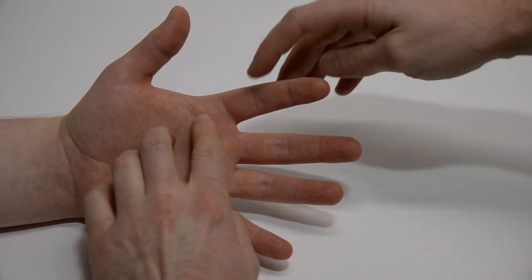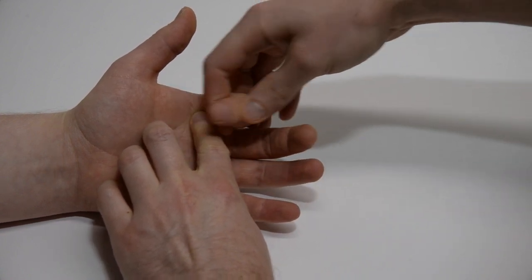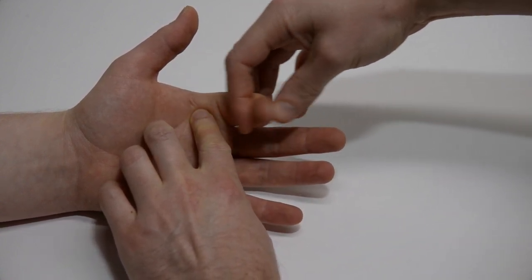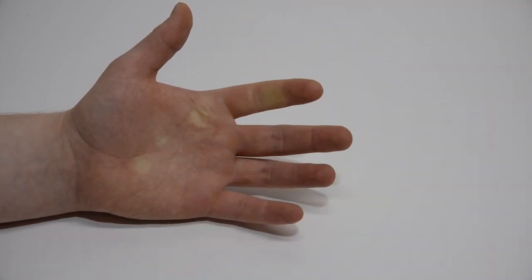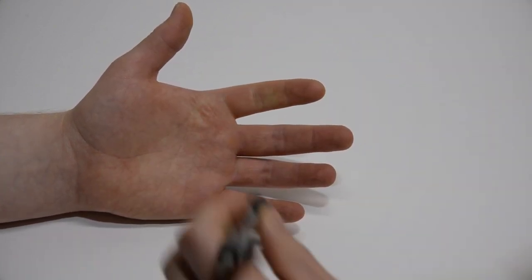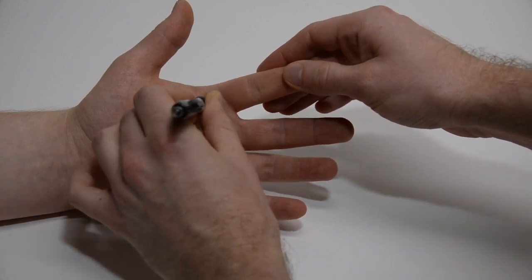To identify the site of the injection, the flexor tendon of the involved finger is palpated at the head of the metacarpal. Feel for the thickening of the flexor tendon and for the site of triggering as you flex and extend the finger. This is the site of the injection. Make a skin indentation at this site.